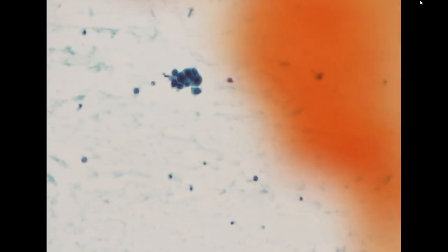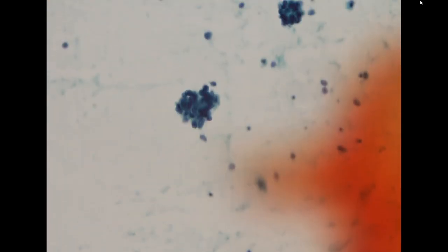The clinician will also perform a direct smear from the diaphragm. As you can see here, we also see some high-grade adenocarcinoma cells in the diaphragm smear. So this is advanced stage high-grade serous carcinoma, and this is very typical, something we see commonly in our practice.